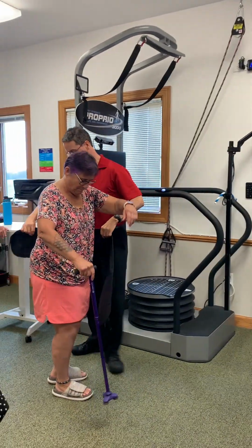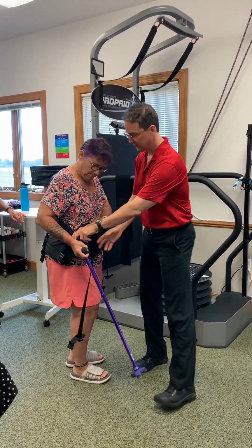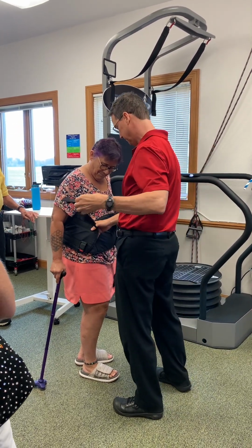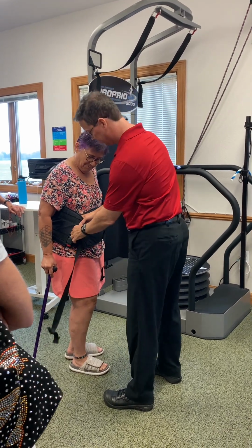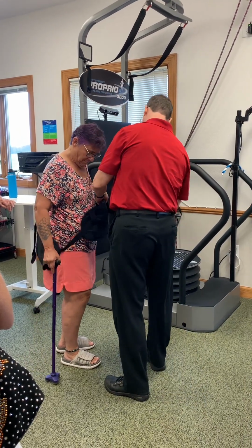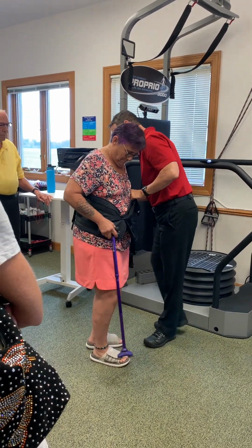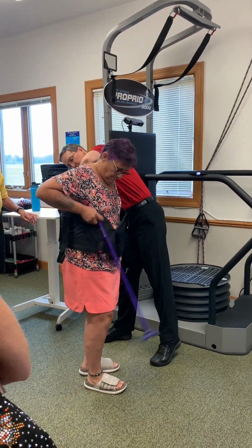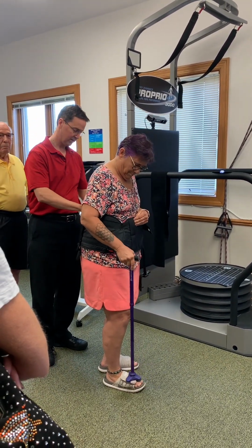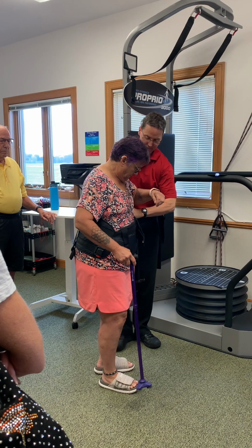We put a safety harness on her. So I'm going to put that around her, if you wouldn't mind. Hold on there and there. I'll get you strapped in. So safety first, we'll see that. That's it. There we go. We'll snug that up a little bit. Snug that up a lot.